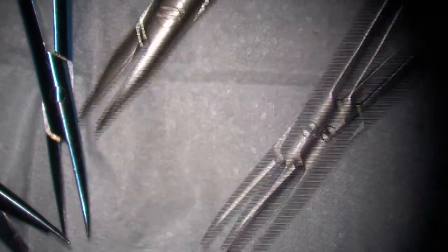So what's the other difference? Yeah, the color is also a difference. The color like this is the titanium instrument. This is stainless steel. The difference is that the titanium instrument won't get magnetized. Every metal can get magnetized, because of the earth, or if the OR uses some magnet things. Once it gets magnetized, it's annoying because the needle is always kind of attached to it. Yeah, it's making it hard to use. So you want these demagnetized. Yeah, and then we have to demagnetize. That's the tool for it. But it's hard because it generates a lot of heat.